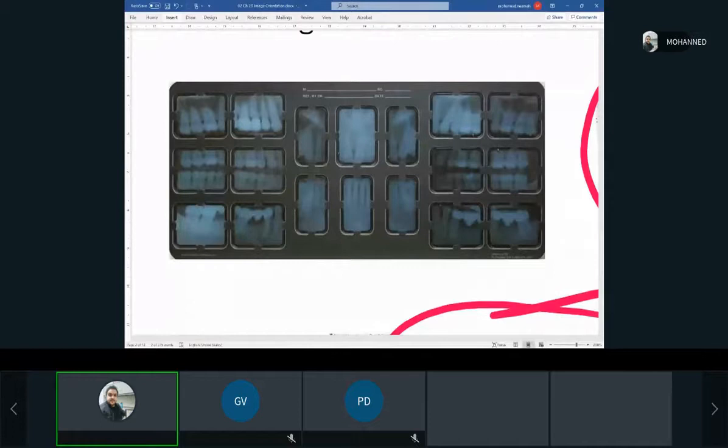And if I look at it like this, let me stand here, my left is the patient's right, and my right is the patient's left, correct? But I can do this, and now I'm inside of the patient's head, right? My right is their right, and my left is their left. So that used to be done with this type of film because it's translucent, and you can just hold it that way, or hold it the other way, technically, and read it. Does that make sense? Yes.